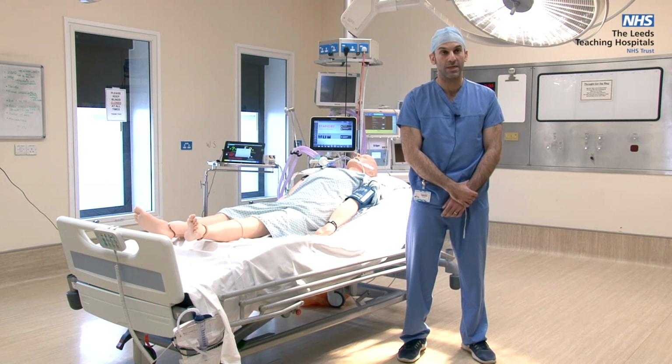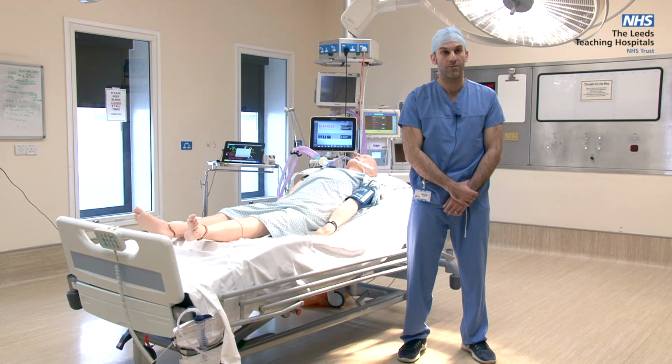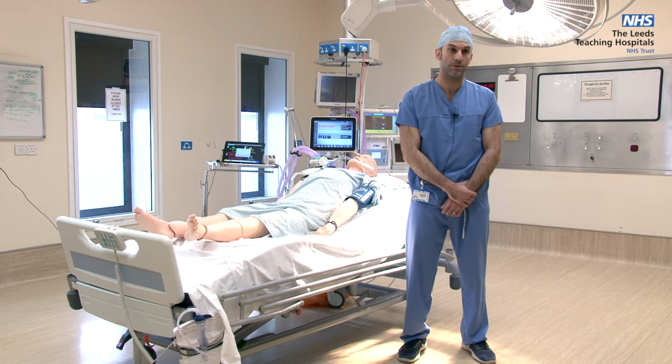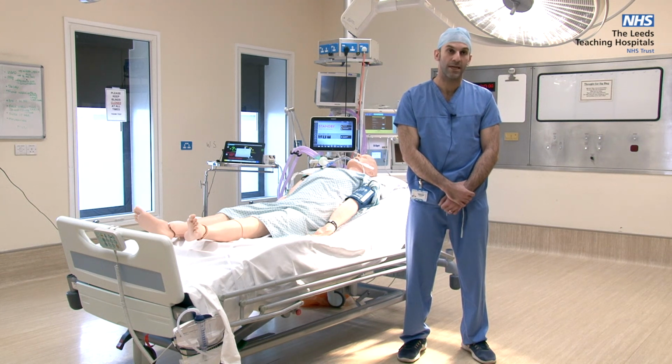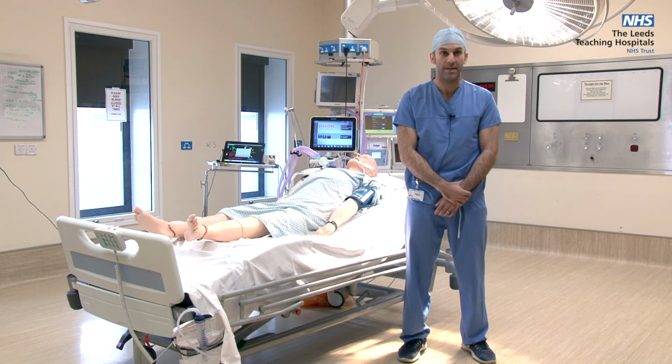However, we are also keen to offer guidance during this early period when we will be performing procedures that are new to us and outside of our comfort zone. The reason we are producing these guidelines and these videos now is to ensure that we have a repository to provide guidance to ensure that everyone is performing this procedure as safely as possible at any given time.